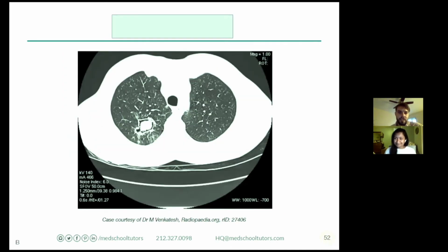All right. So patient presents. This one's a little bit trickier, I think. So what are we thinking? I don't want to give away too much for you guys since you've been getting everything so quickly. Nailing it. Yeah. Oh my gosh. Why do we even try? I know. All right. Okay.